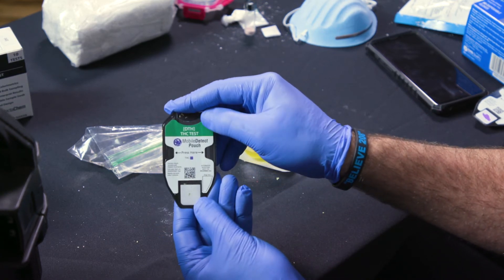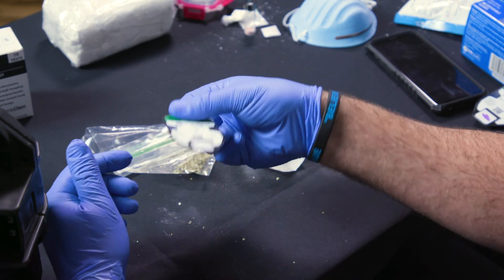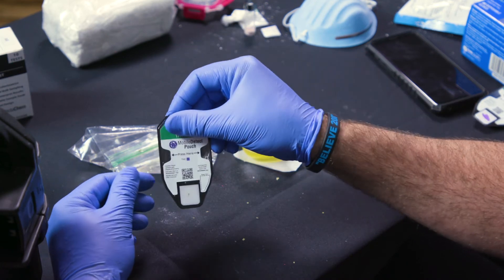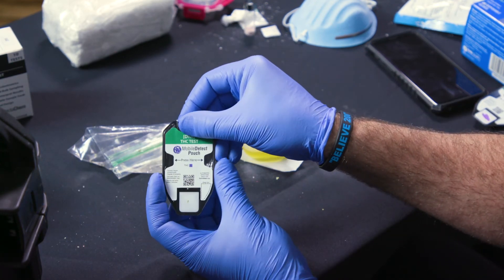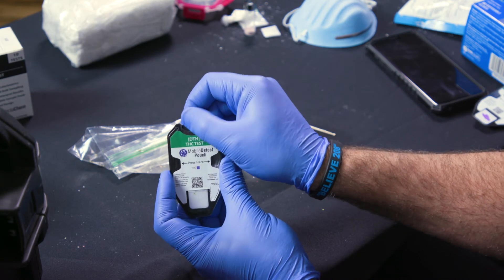Once that is fully saturated, then you want to break the right side. Snap that ampule, shake that down. You may want to move it around a bit to make sure all the reagent is pooled down there.